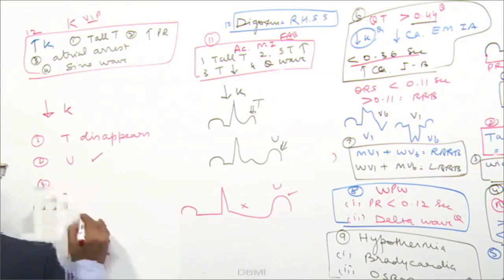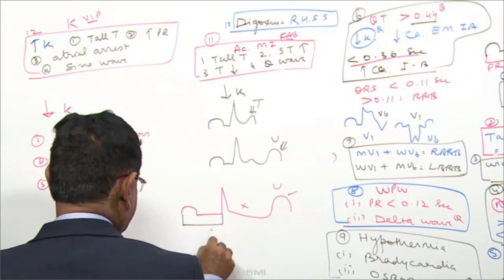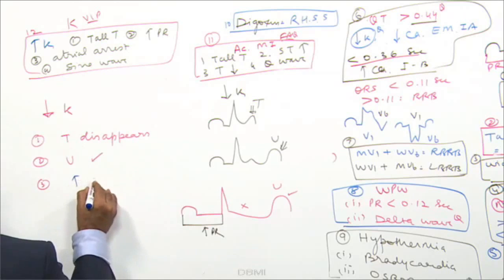Third, there is prolonged PR interval. This PR interval is prolonged.